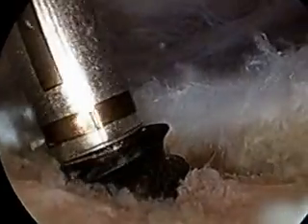Here we are putting in what's called a carbon fiber anchor. This material is especially strong. It gets completely embedded in the bone. There are 3 sutures attached to that anchor, which you saw being screwed into the bone.